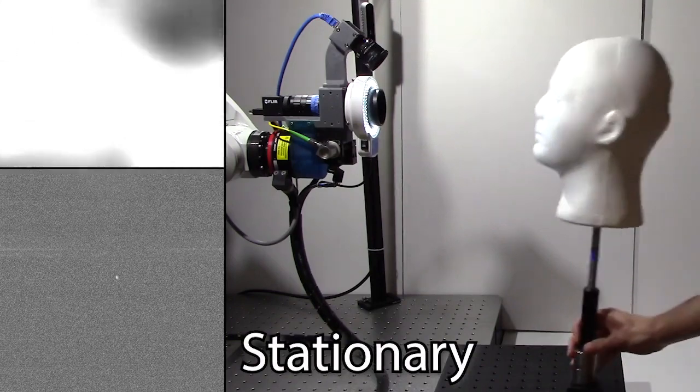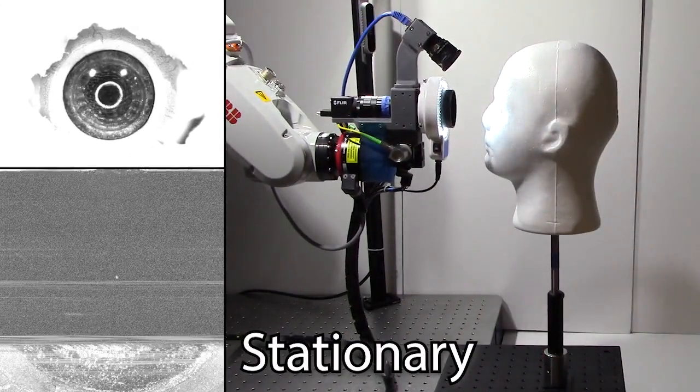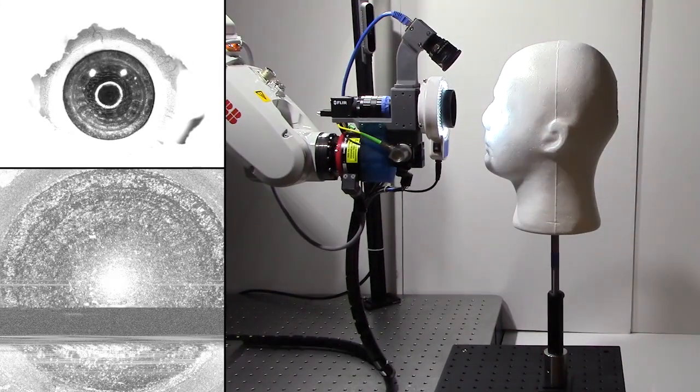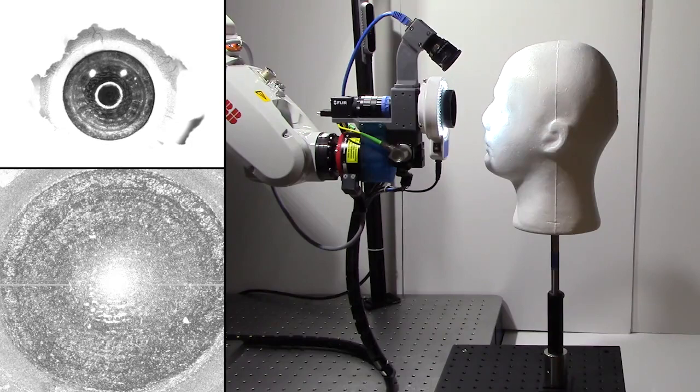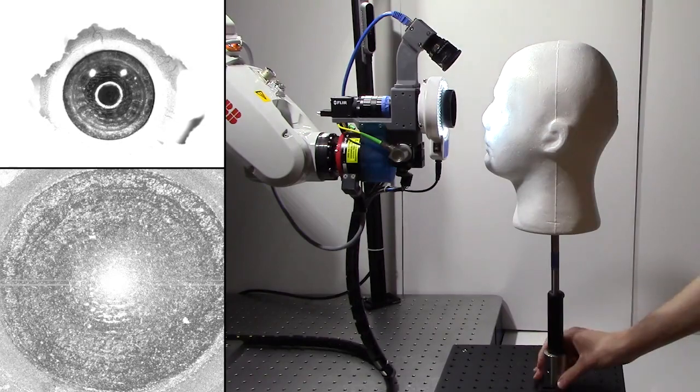We start by showing alignment with stationary targets. Using the eye and pupil tracking cameras, the robot obtains a high-quality OCT volume of the eye within seconds.